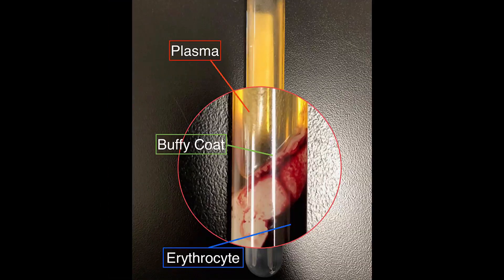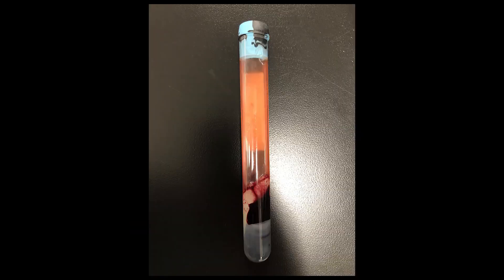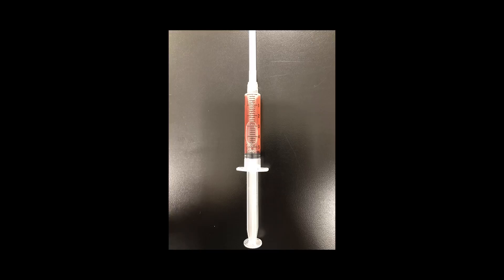Here is the patient's whole blood after it has been centrifuged. Notice the plasma layer, buffy coat layer, and the erythrocyte layer. After centrifugation, gently invert the tube a few times until the plasma gets a pink color as seen here in the image. Then collect the supernatant fraction using a syringe with an 18 gauge needle. Your PRP injection is now ready to go.